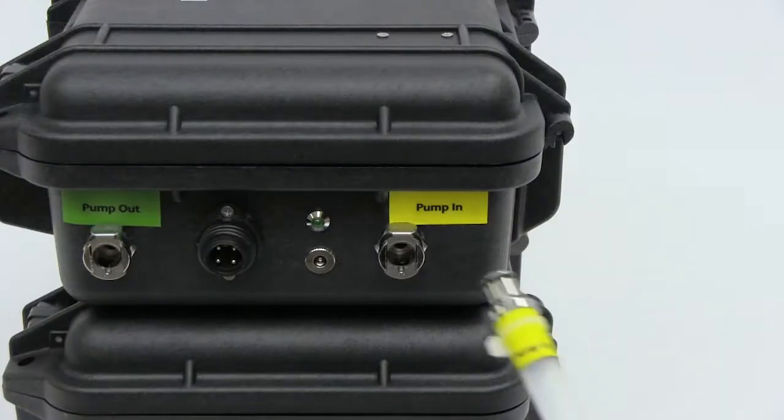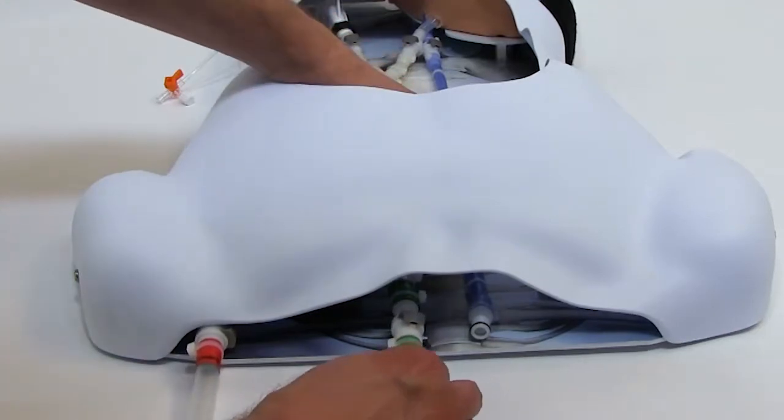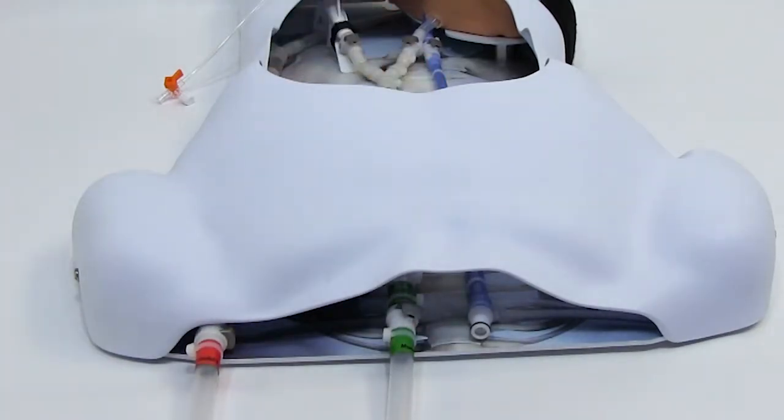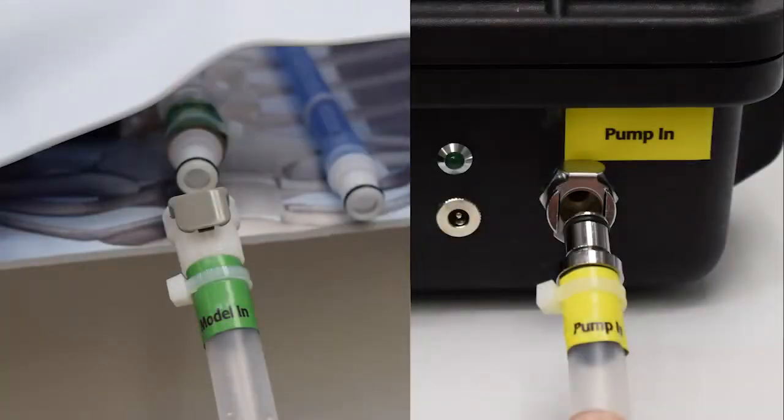Connect the tubing to the pump, sump, and body model. There are three tubes with red, green, and yellow labels. Connect the corresponding colors of plugs to their sockets, ensuring the metal plugs fit into metal sockets and plastic plugs fit into plastic sockets.